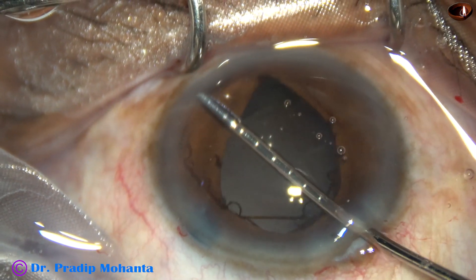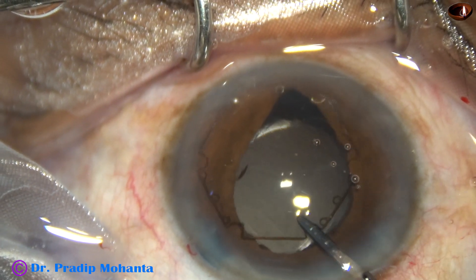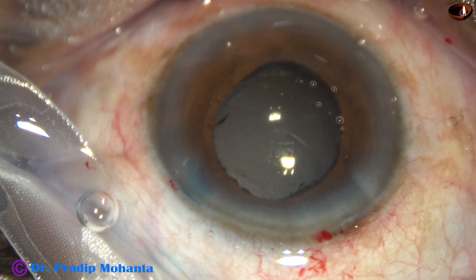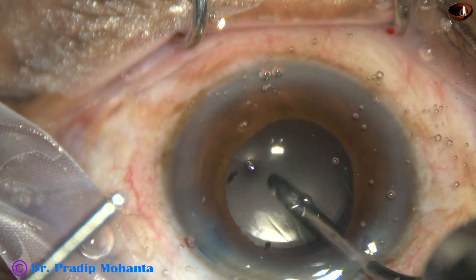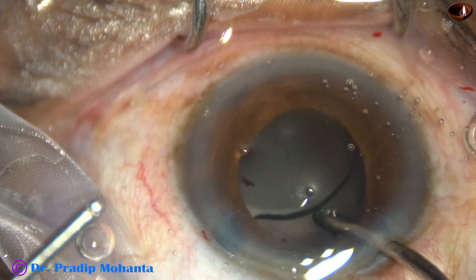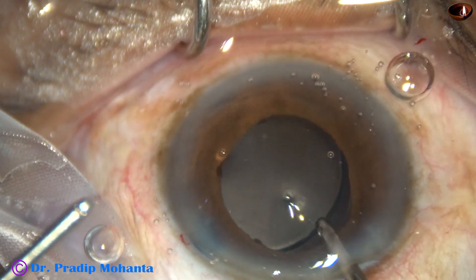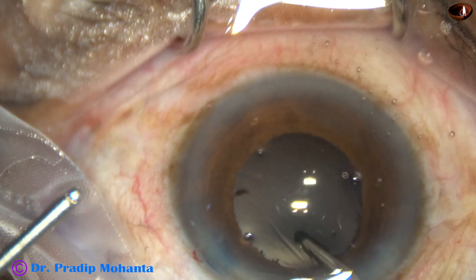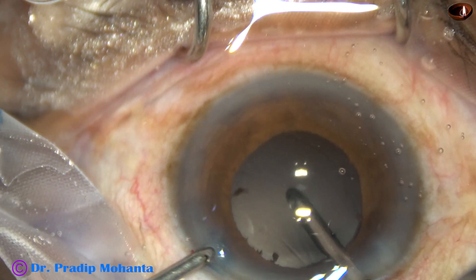And this is how we can remove the B-hex. Hold one haptic, pull centrally, go peripherally and all the flanges are untucked and the device is pulled out. It takes only a few seconds to remove the B-hex pupil expansion device and we don't need any injector system. This is removal of visco from the capsular bag, and this is removal of visco from the anterior chamber. When we have only one side port, we can use bimanual irrigation aspiration carefully.